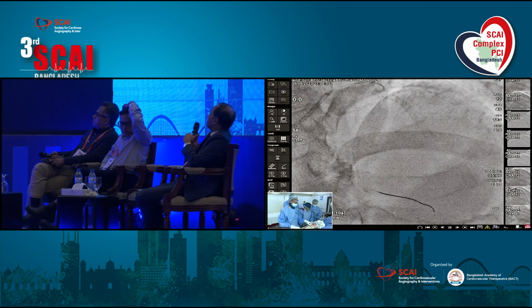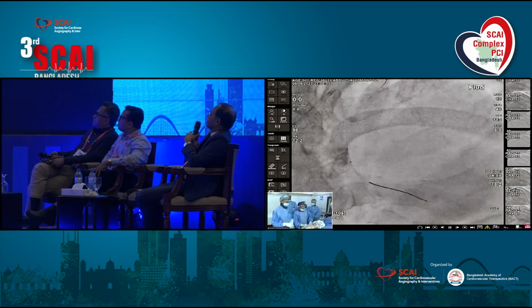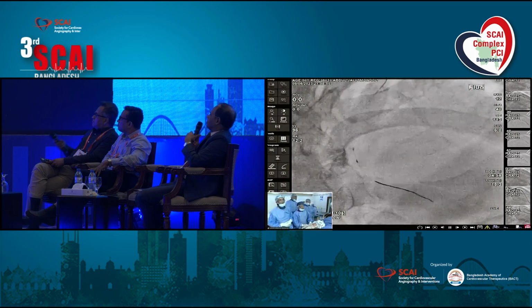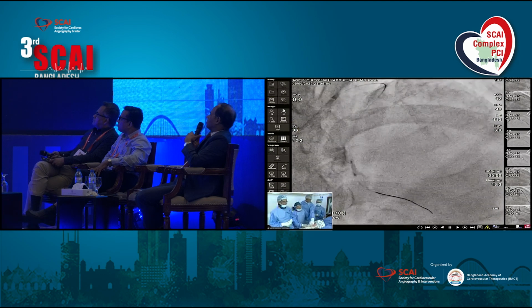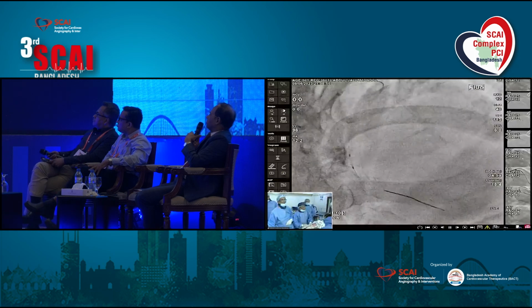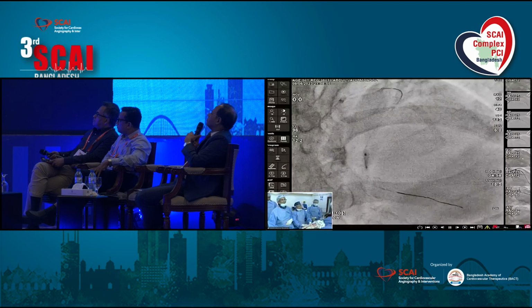Now open this and make it air free. So you would like to do the pre-dilatation, then stenting? Yes. So you don't have to stay with us, but we will perform this obviously. Another 4 minutes, go ahead. If you give us 10 minutes more, then we can show. So it is a 2.5 or 2.75 balloon? 2.5. Okay, go. 10, 12, 14. Good. Okay, good.